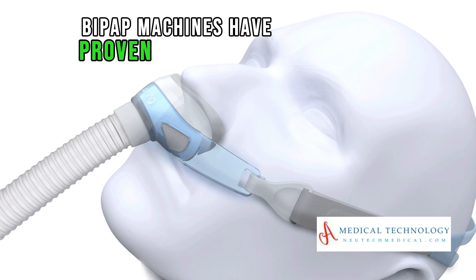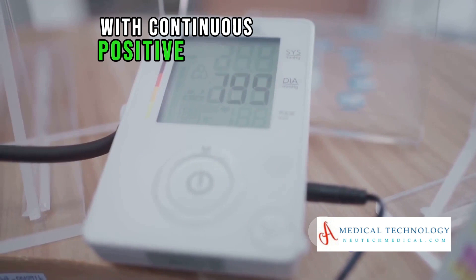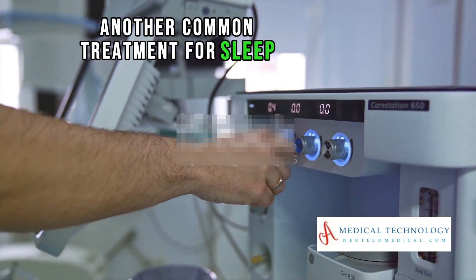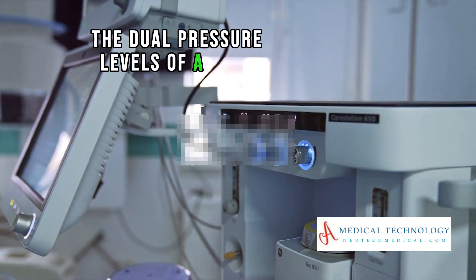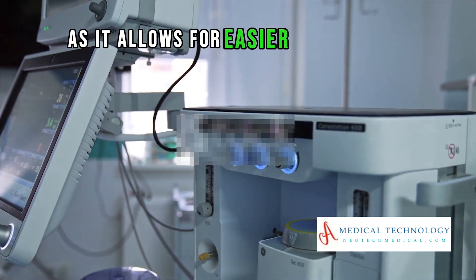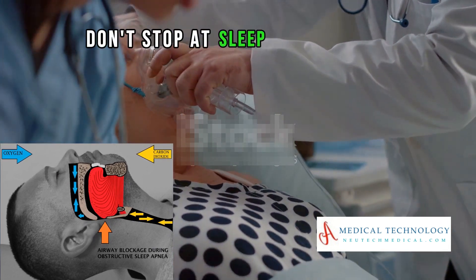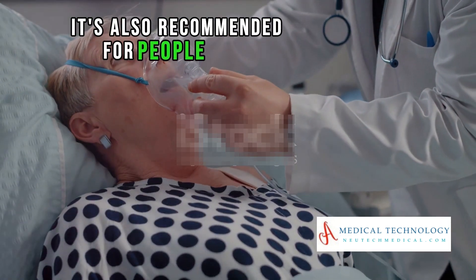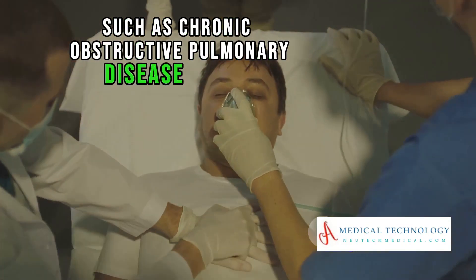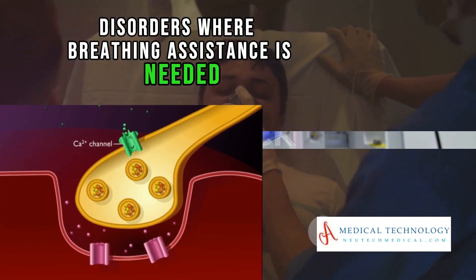BiPAP machines have proven to be a game-changer for individuals who have difficulty with Continuous Positive Airway Pressure, or CPAP therapy, another common treatment for sleep apnea. The dual pressure levels of a BiPAP machine can be more comfortable for some patients as it allows for easier exhalation. It's also recommended for people with conditions such as COPD and neuromuscular disorders where breathing assistance is needed.